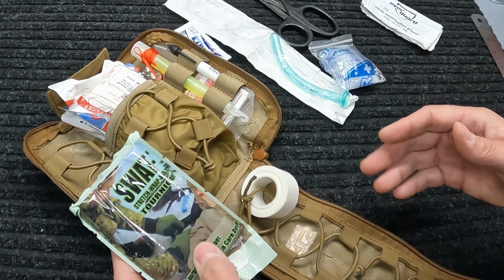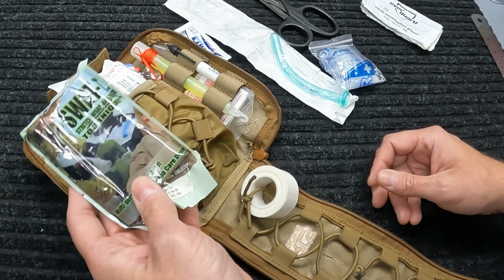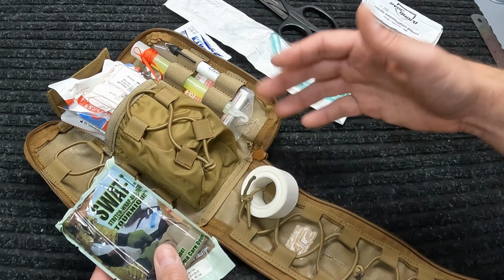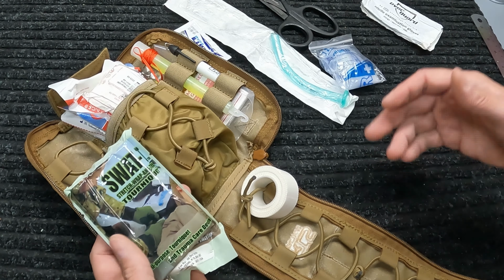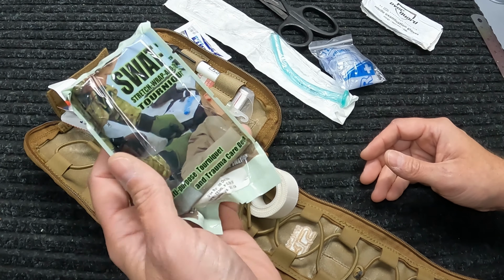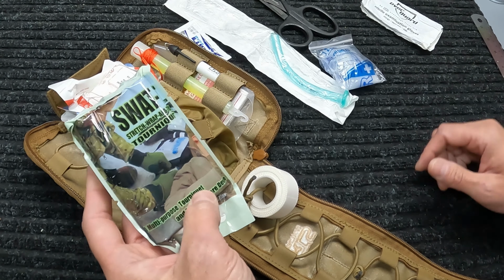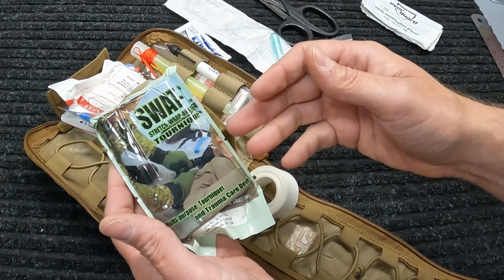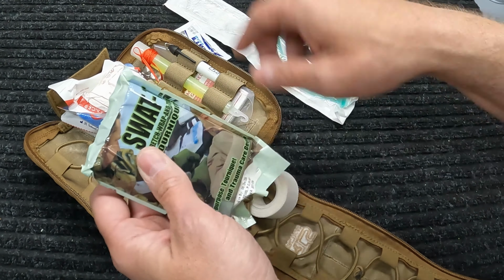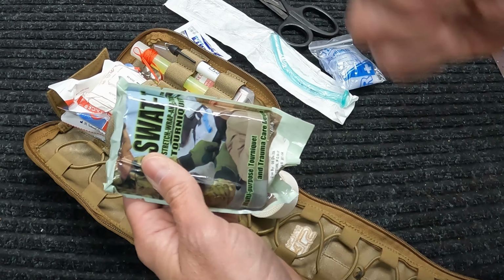Now that being said, they do offer a couple of other options. If you order this, it's going to come with this regardless, but you can have them add others. A lot of people are big fans of the CAT type tourniquets, which are excellent. One benefit of the CAT tourniquet over this, personally I would say, is that CAT tourniquets are easy to apply to yourself with one hand. This one is more of a stretch. You get the one wrap and it's going to kind of cling once you get it overlapped, and then you just start pulling tighter and tighter.